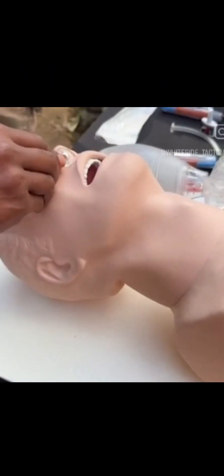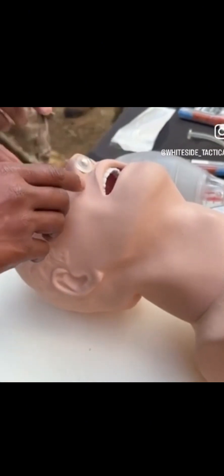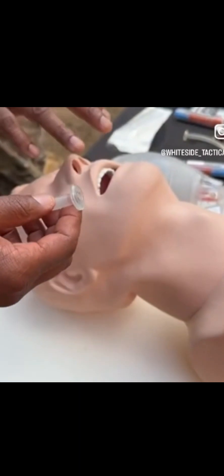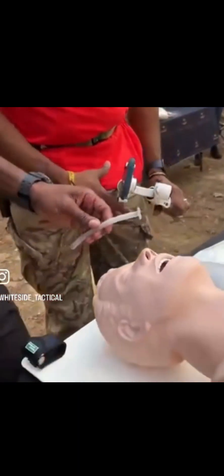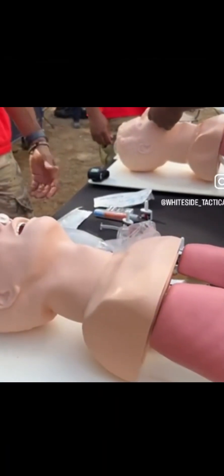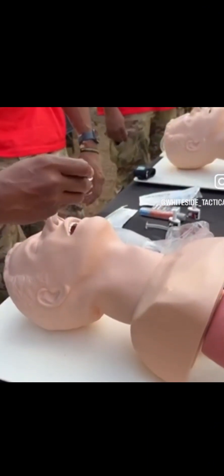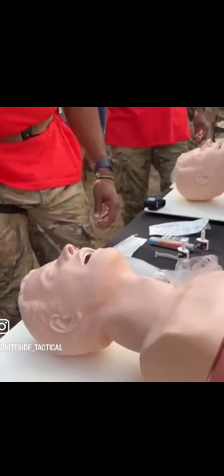The only time you would not use this is if somebody had a head injury, because you don't know if they have a facial fracture. If somebody fell and busted their head open, don't use it. But for the most part, if it's a medical situation and you know there's no head injury, go ahead. Do you push it in just like that? On a real person you don't jam it in — it's going to be uncomfortable.